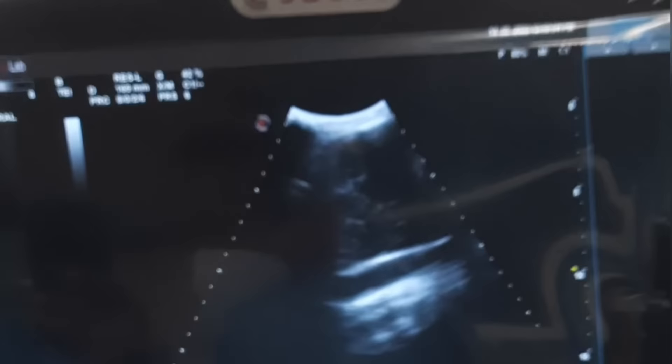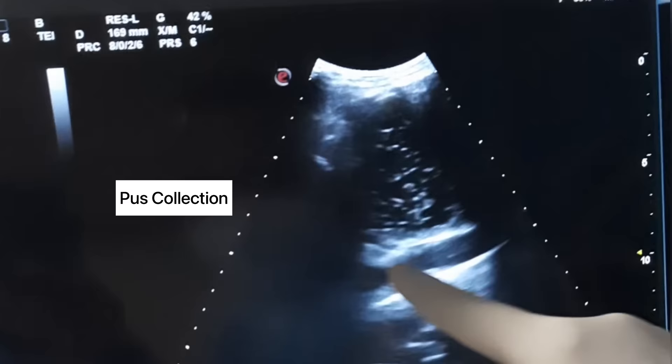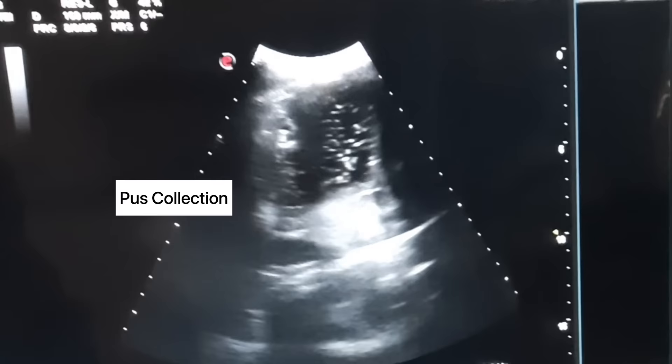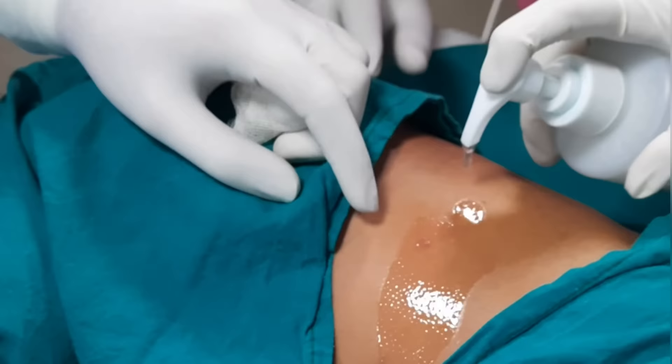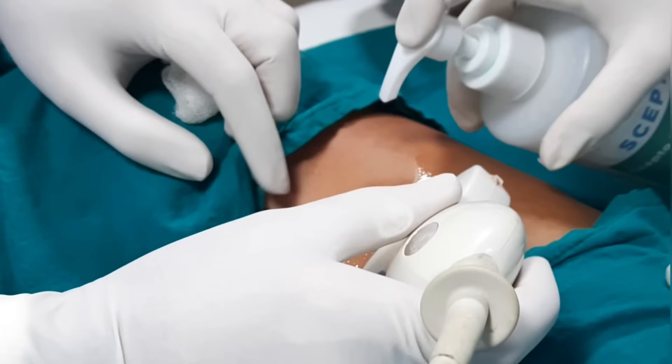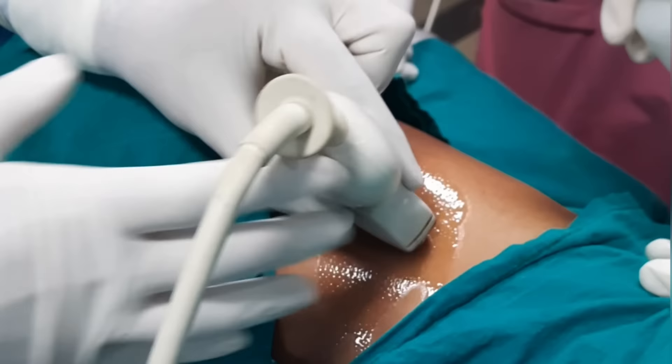On ultrasound you can see there is an opacity with fluid collection. It has a granular appearance which is suggestive of pus. We will mark the site and confirm again by ultrasound. In ultrasound you can see a C-shaped structure at the bottom, which is the diaphragm, and above the diaphragm there is the collection.